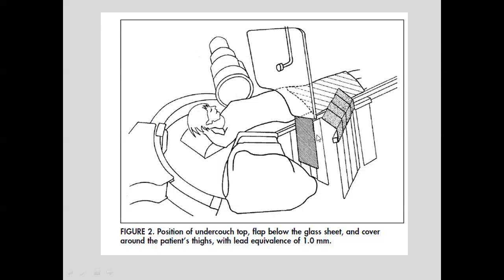Okay. They recommend having this little additional shield coming down. If you go through the EP rotation at the VA, you'll notice we have a piece of lead that comes in perpendicular to the table. That's my simulation of this, okay? And why I do that is, in our EP lab, we use the LAO about 2 times as much as we use the RAO.